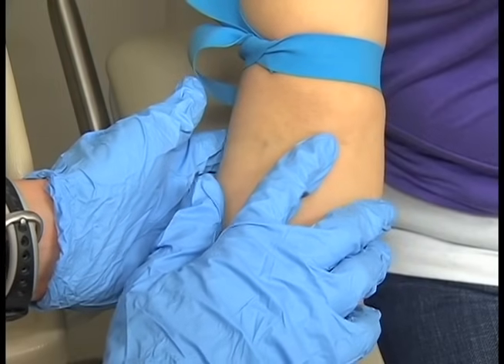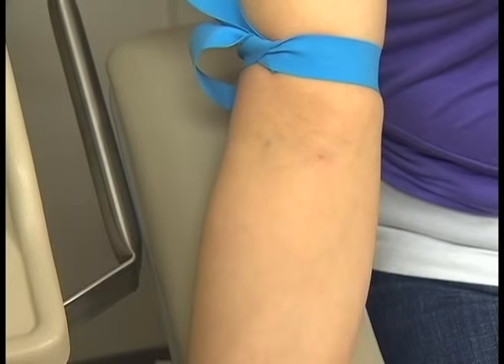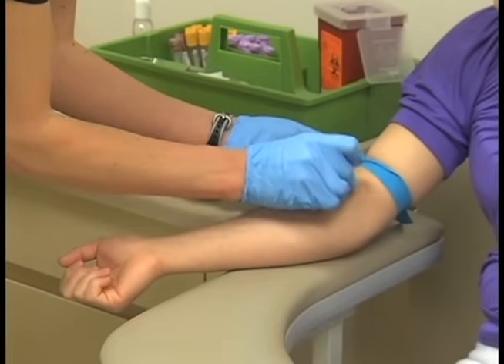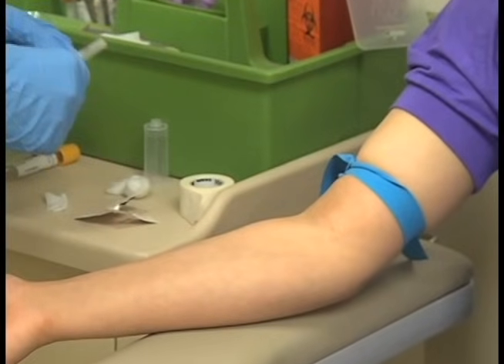Thoroughly palpate the selected vein. Gently palpate the vein with the fingertips to determine its direction, size, and depth. Cleanse the site with an antiseptic wipe using a circular motion starting from the inside and moving away from the puncture site. Allow the site to air dry. After cleansing, do not touch the area.